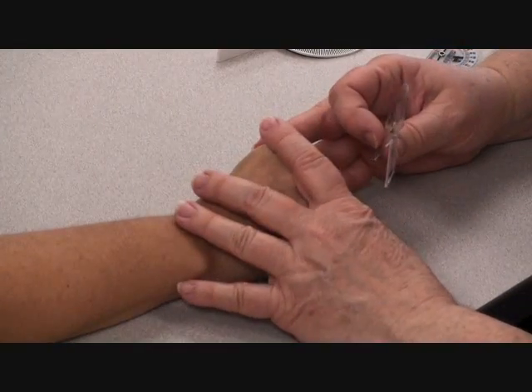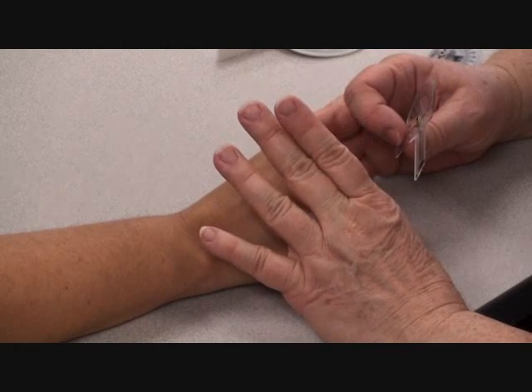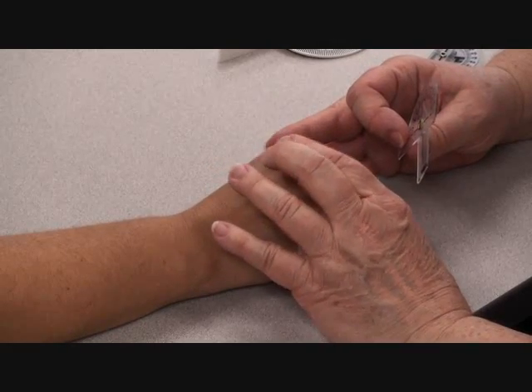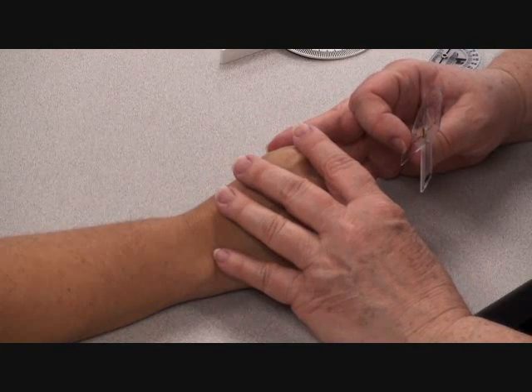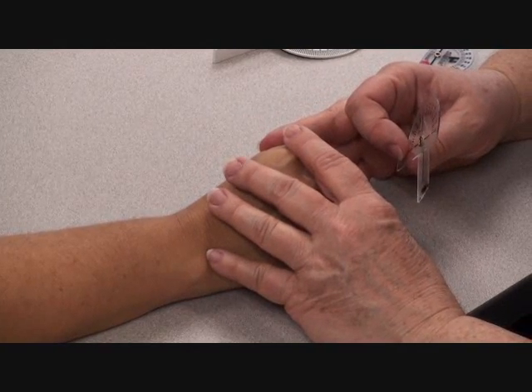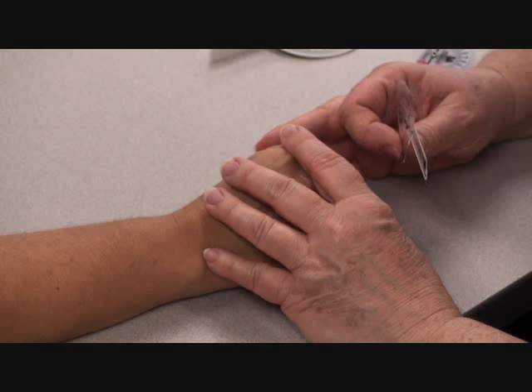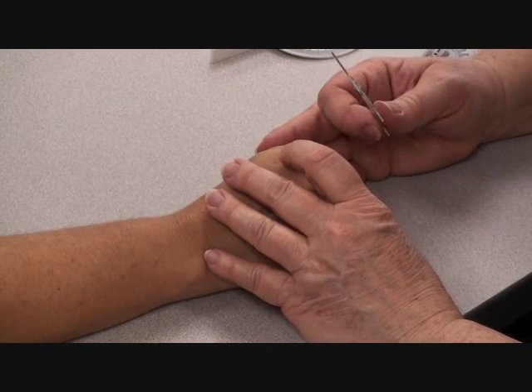Okay. So in the clinic, I would take a survey of my extension if I needed to measure extension on any or all the fingers because, again, our clients in the clinic are not coming to us because they have full range of motion in their hands. If they did, would you be measuring them?